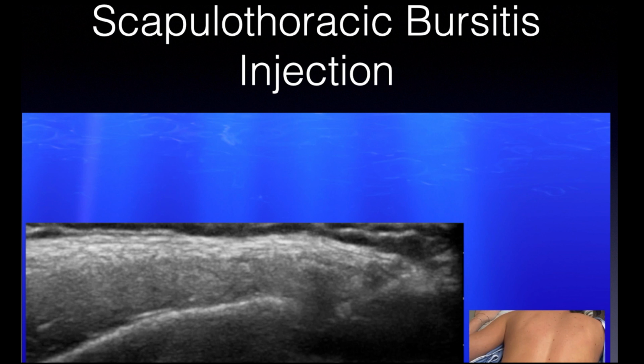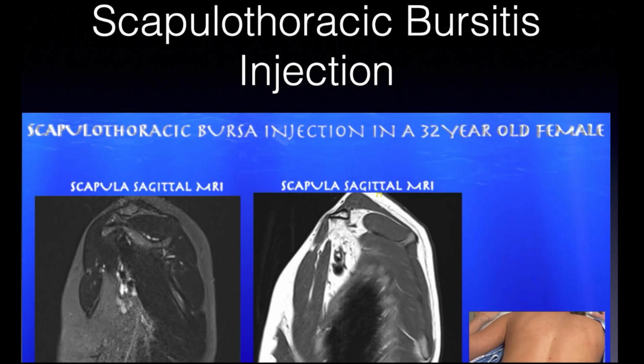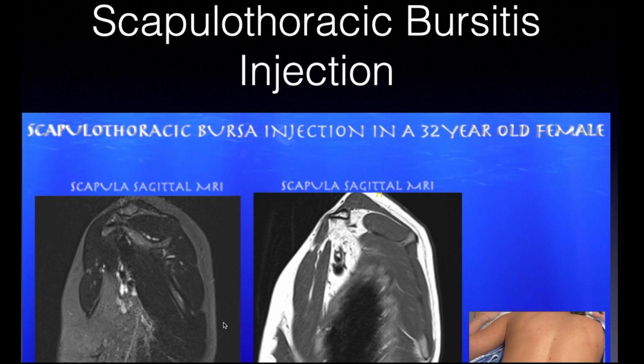The scapulothoracic bursa, there are different bursae. There's the infraserratus, which is below the serratus anterior muscle, between that and the external intercostal muscles and the ribs. That lies at both the inferior angle and the superior angle of the scapula. And then you have a supraserratus bursa, which is between the serratus anterior and the subscapularis muscle. So it's complicated anatomy. This is one of those cases where you may want to go to your room and review your anatomy before you do the procedure.